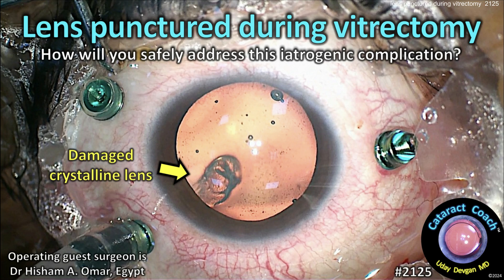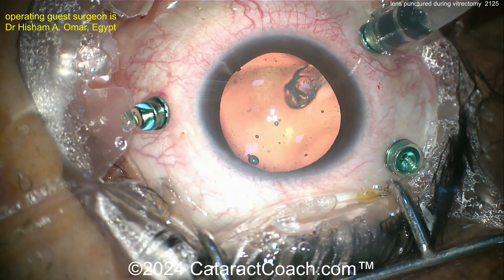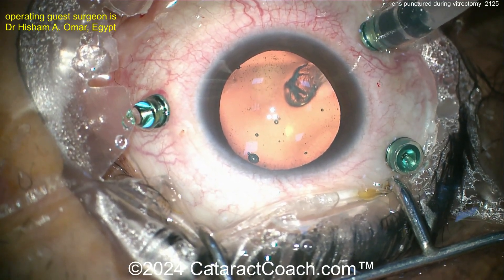CataractCoach.com presents: lens punctured during vitrectomy. How will you safely address this iatrogenic complication? This is a tough case — the patient had a prior pars plana vitrectomy and you can see the damage to the crystalline lens. The posterior capsule is punctured.